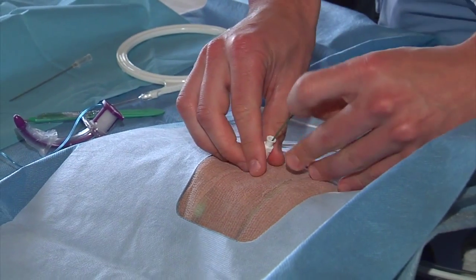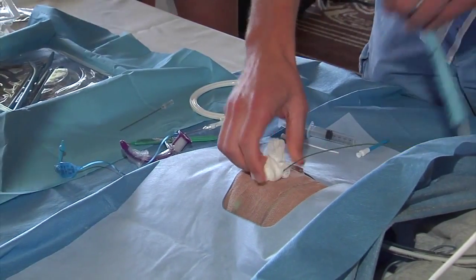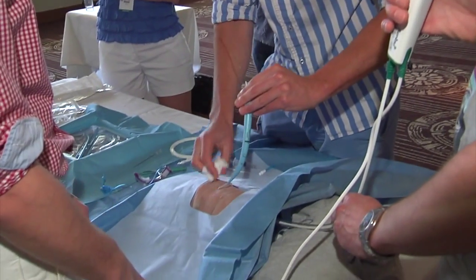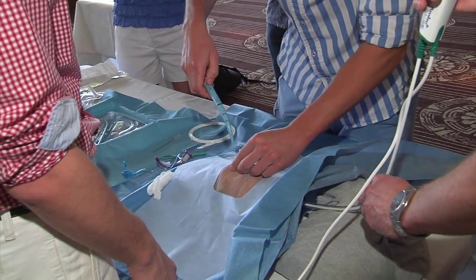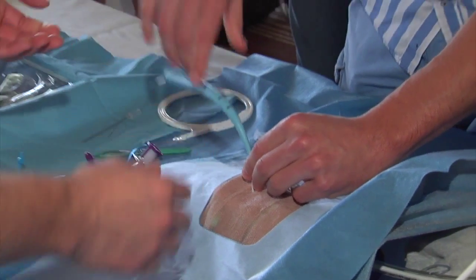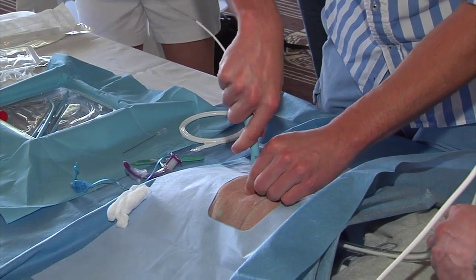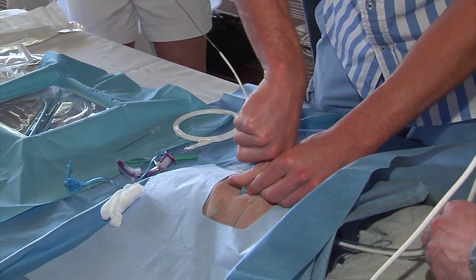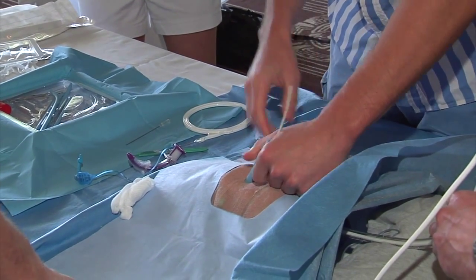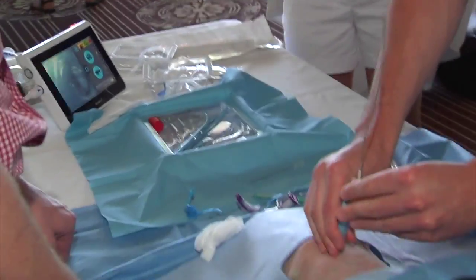At this point have some gauze ready because blood and air will come up, and obviously everyone should be wearing PPE and glasses. Get the white line just at the back of this bit, then slide the whole thing in one slow controlled movement, keep sliding until you reach the black line. Then leave the wire in and the white inner piece in — that's how this particular set works.